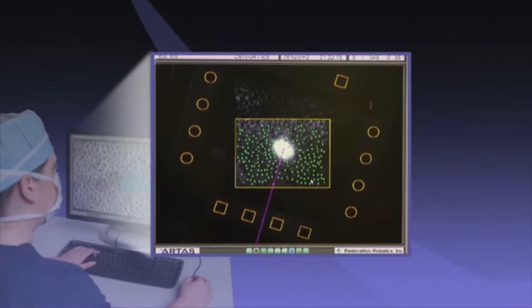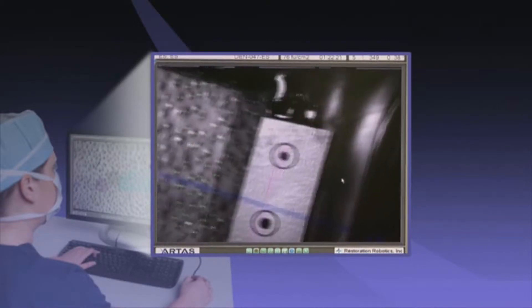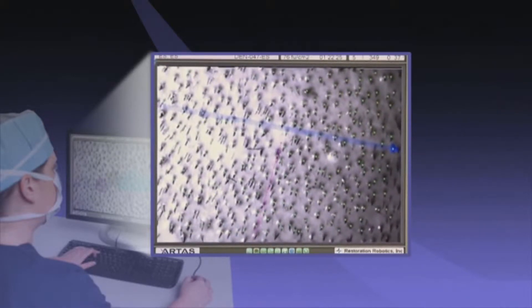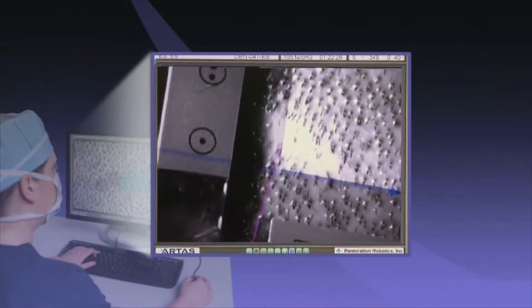The ARTAS System empowers doctors to digitally identify and track each follicular unit with pinpoint accuracy. The doctor directs the ARTAS System as it calculates parameters such as hair angle, distribution, and density to successfully harvest healthy follicular units for implantation.